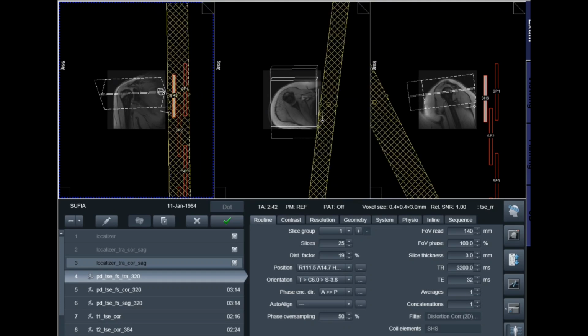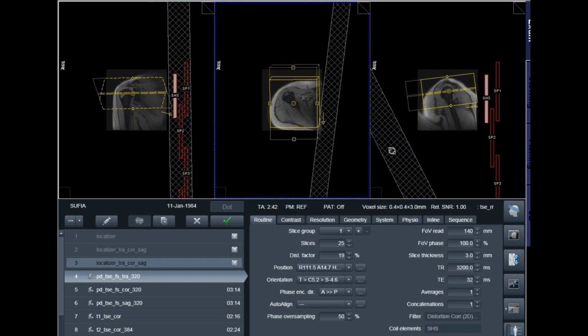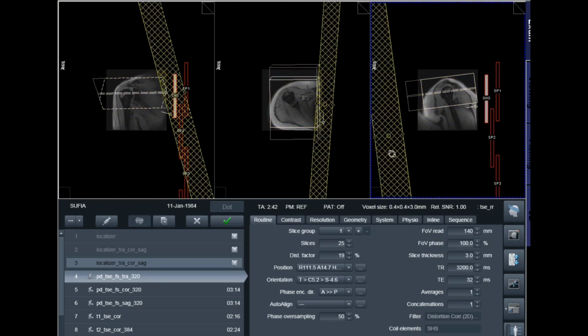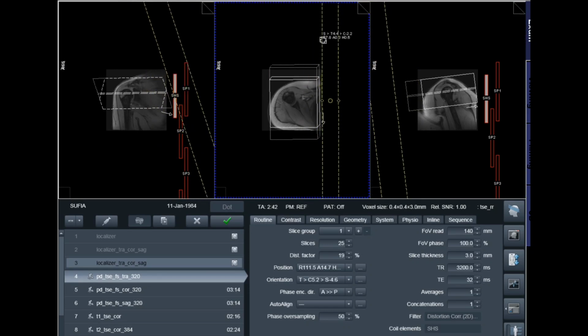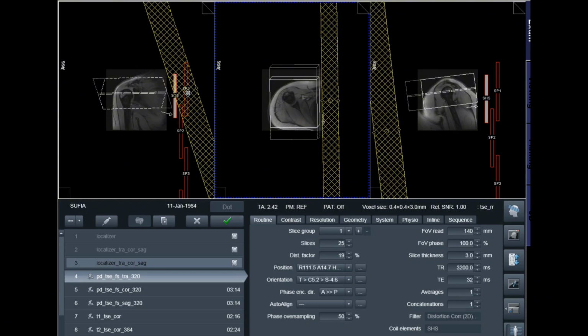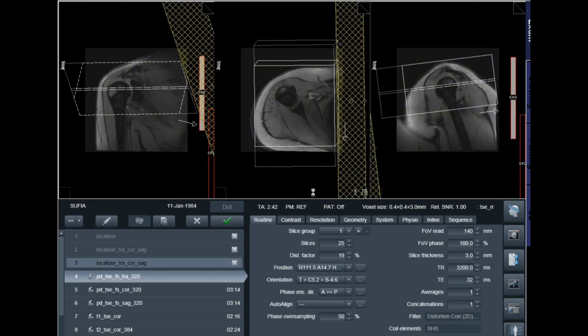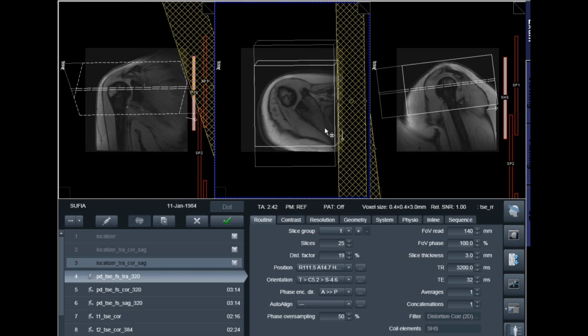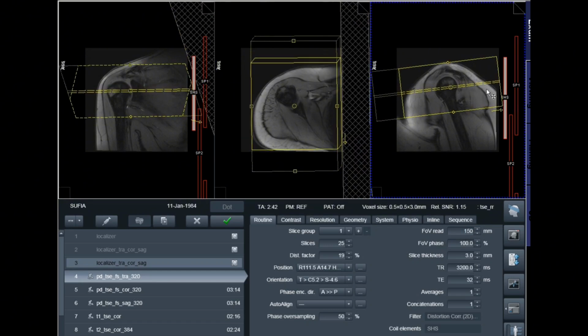Clinical indications. MRI of the right shoulder is indicated in chronic shoulder pain, restricted range of motion, suspected rotator cuff tear, post-traumatic shoulder injury, shoulder instability or recurrent dislocation, frozen shoulder or adhesive capsulitis, sports-related injuries, preoperative planning, postoperative evaluation. MRI protocol and sequences.